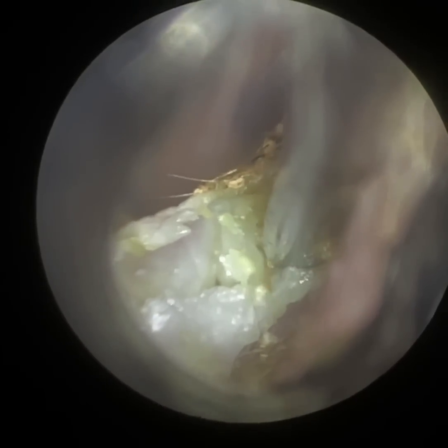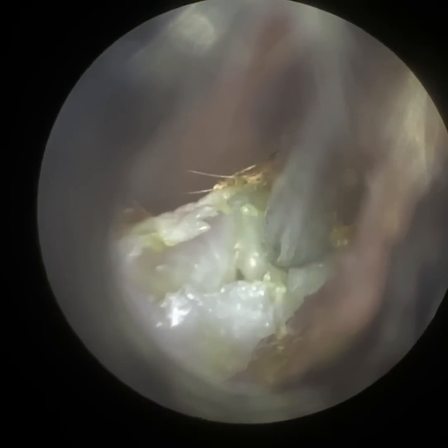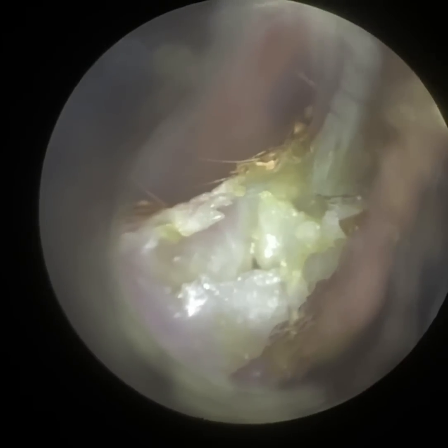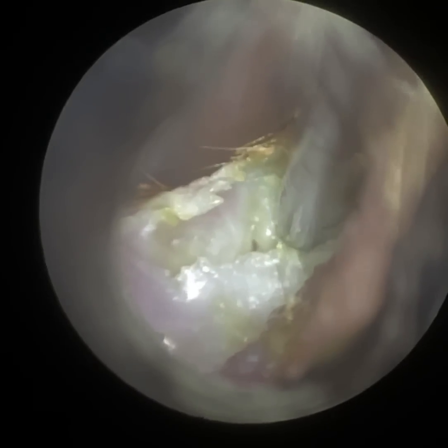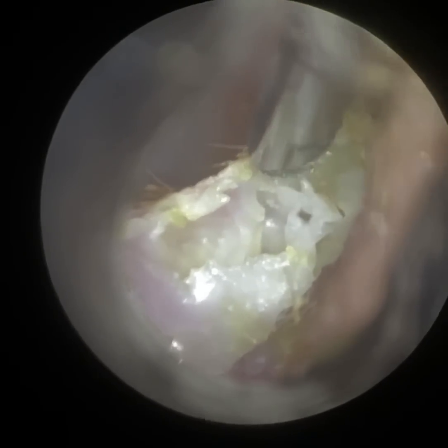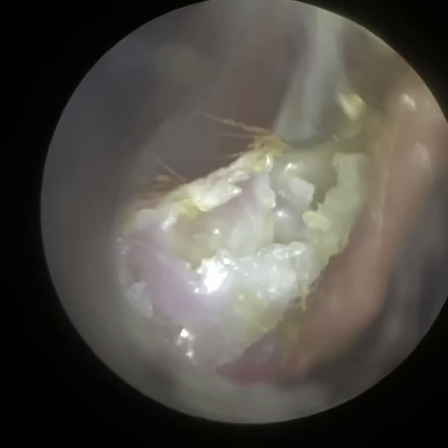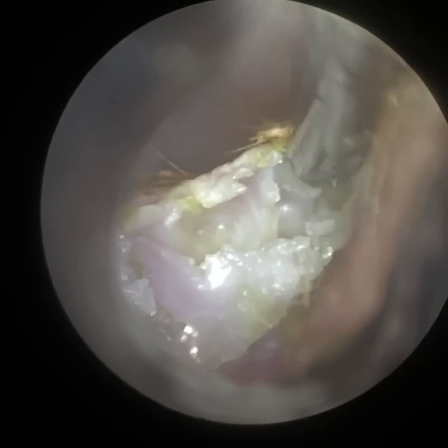It's almost like a cliff edge here — this shouldn't be there. That should all be bone, and on top of that there should be a layer of skin. So we're looking really into the temporal bone here. The skin layer on top did move, and the bone felt very unstable there. So we're just being careful and I just want to avoid that area.